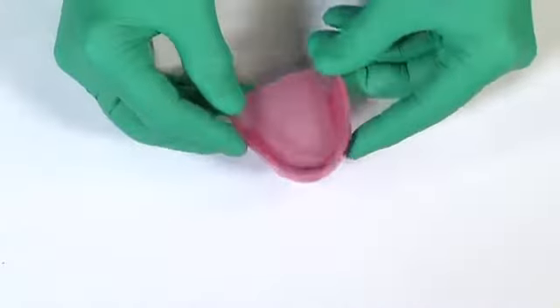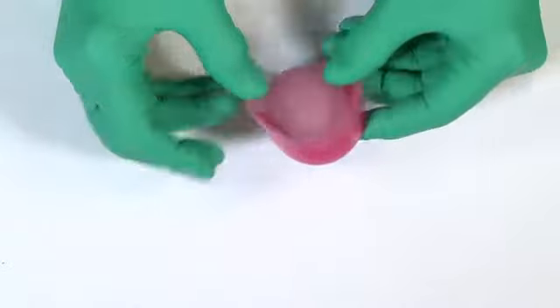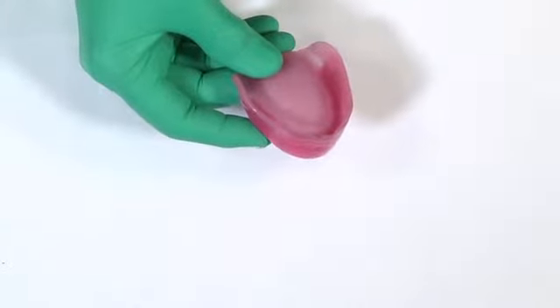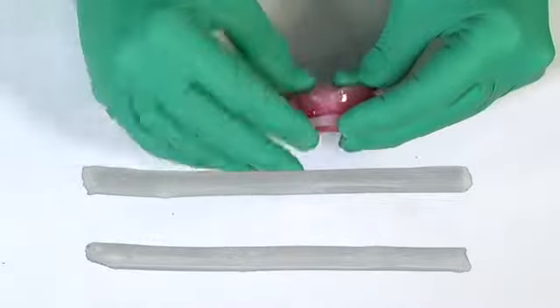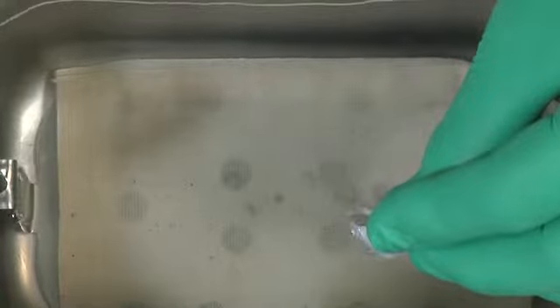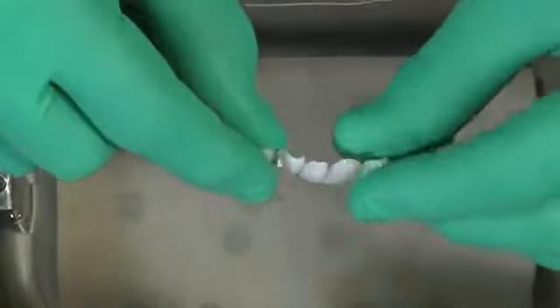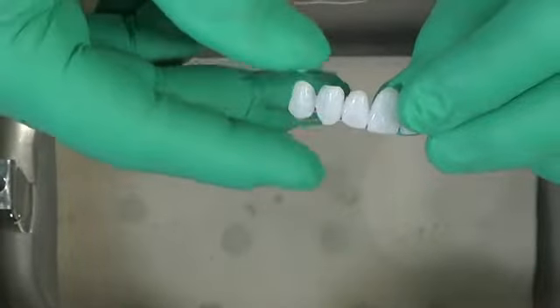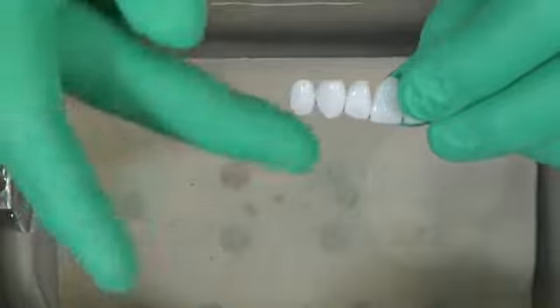Here's how to use the Visionaire Dental Shells on an occlusal rim. After establishing proper occlusal relationships, simply place the white wax over the anterior area. Dip the dental shells in a hot water bath at 170 degrees Fahrenheit or 80 degrees Celsius for 10 to 15 seconds. The shells will become rubbery and easy to manipulate.